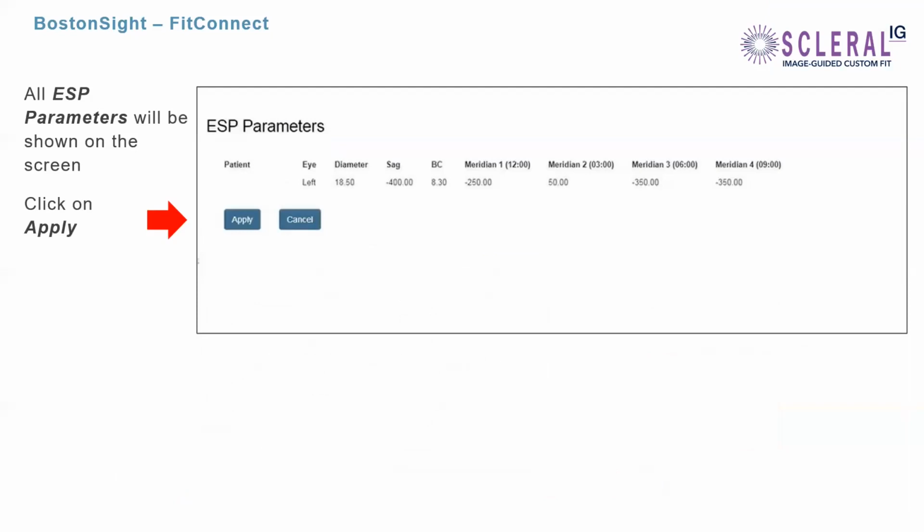They can obtain over-refraction from a trial lens, or they can choose to simply go with no over-refraction at this point, and just push the lens based on the data. Then once you get that lens from the lab, you can use that to over-refract. If you have one of our lenses that has the eccentricity options, you can apply and obtain the over-refraction that will maximize your chances of getting it right from the first go round, and then you input the over-refraction in that previous screen that you showed, Reinier.